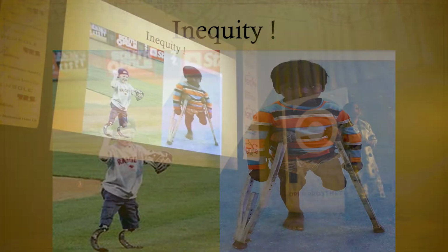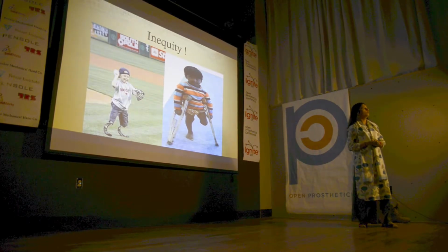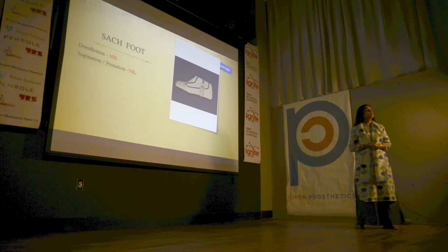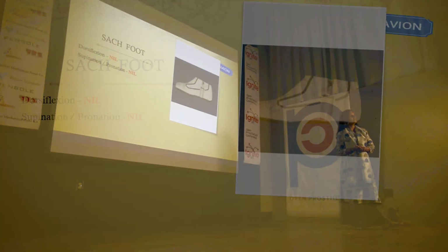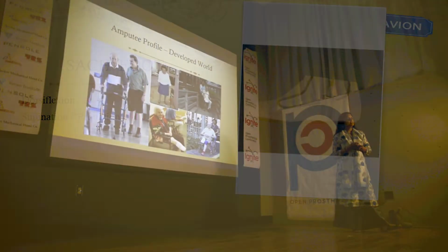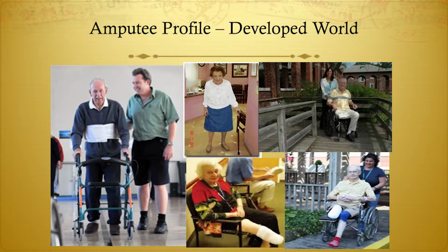In fact, we were so consumed by cost that we started believing cost to be the foremost deterrent in prosthetic services in India. And we set about making inexpensive replicas of what was available in the West at that point of time, which was the Sach foot. So very enthusiastically, we started providing our patients with the Sach foot and an aluminium limb. However, the excitement was very short-lived because we had a near total rejection.